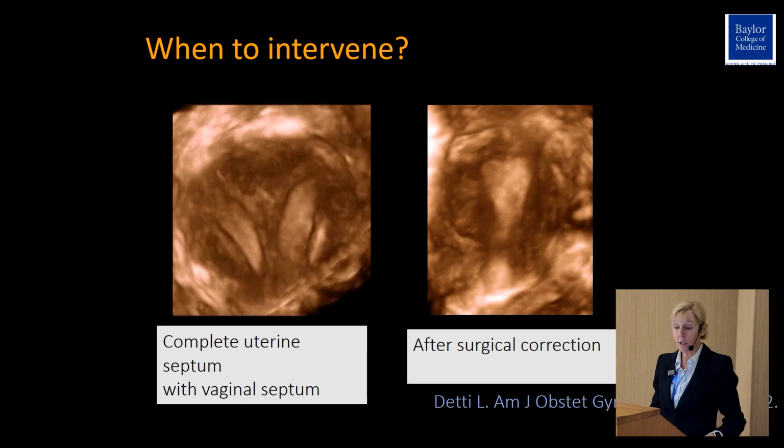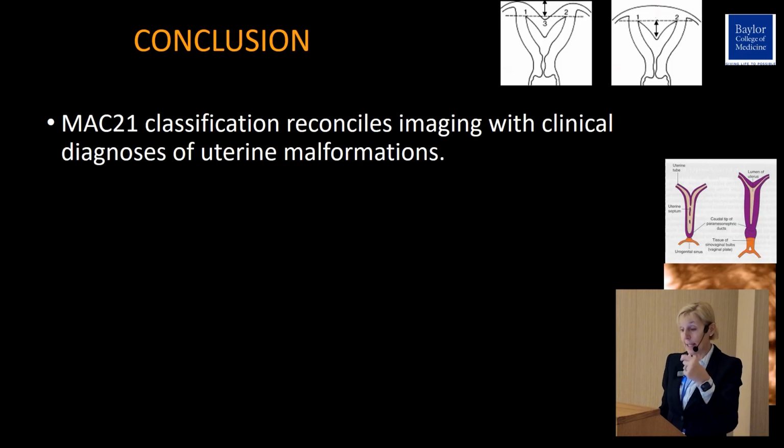So if you look at the width of the uterus here, it was about 7 centimeters. But then after surgery, this was a completely normal uterus with a 4.5 centimeter width. And so that again taught me how the uterus can recoil and regain its shape as soon as you just detach the anterior from the posterior wall that holds the whole uterus down and the cavity much wider.